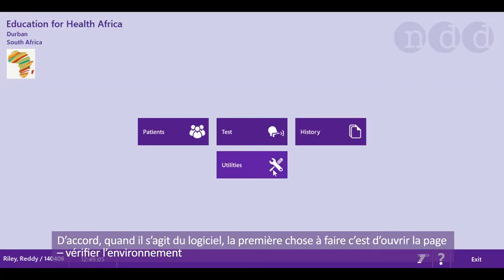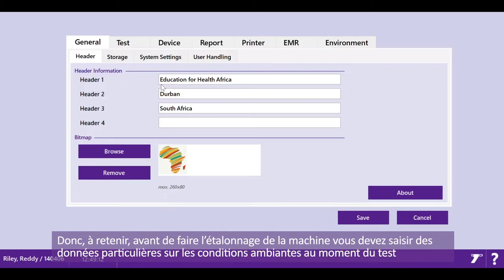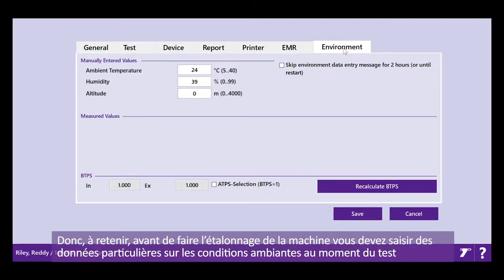When it comes to the software, the very first thing you need to do is go into check your environment. Remember that before you calibrate your machine, you've got to make very specific entry of the ambient conditions at the room of test at the time of testing.